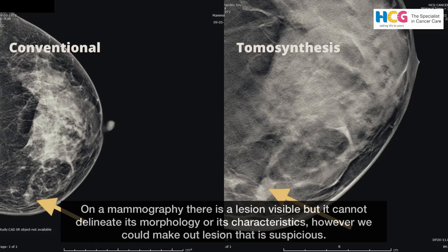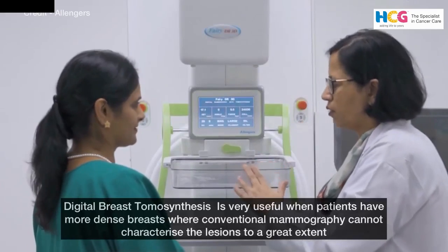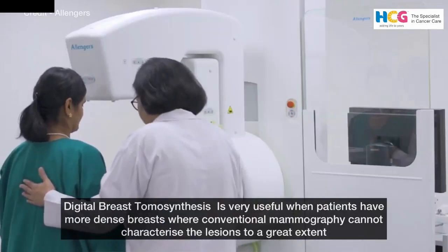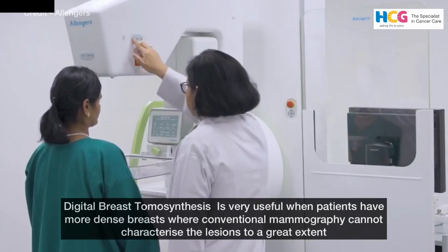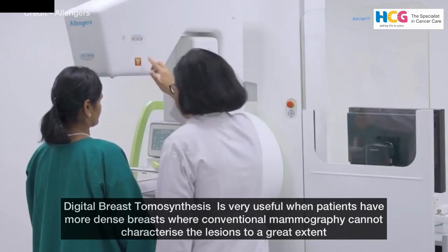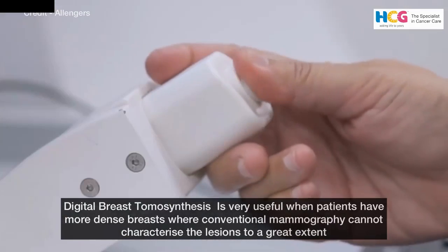The same patient was taken for digital breast tomosynthesis as well. It could very well tell us that it was a BI-RADS 5 lesion, and we went ahead with a biopsy of the same patient. Digital breast tomosynthesis is practically very useful where patients have more dense breasts, where conventional mammography cannot characterize the lesions to a great extent. There, digital breast tomosynthesis is of great help.